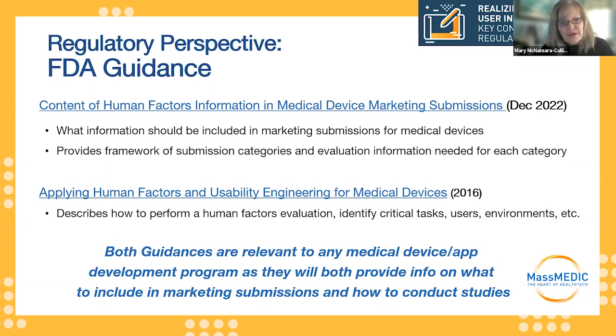perspective. So FDA has recently published a guidance just about a month ago in December. That guidance document provides us with a clear framework for the kinds of information that are required in marketing submissions. So what kind of human factors information is required in those submissions?